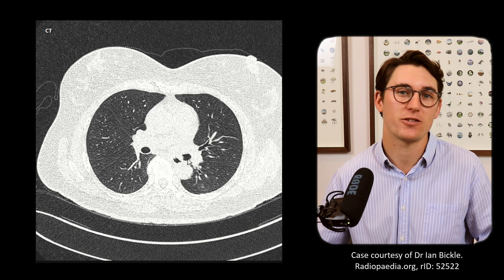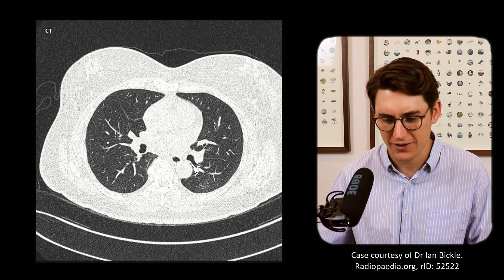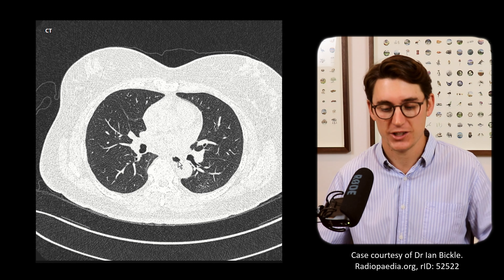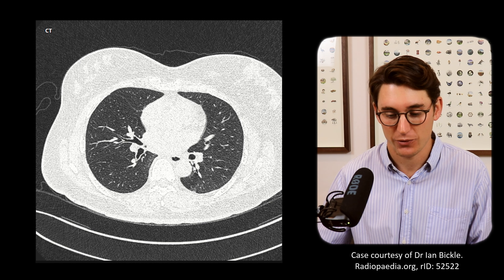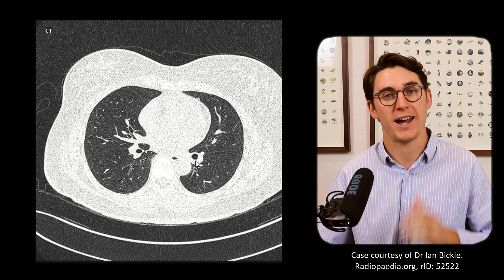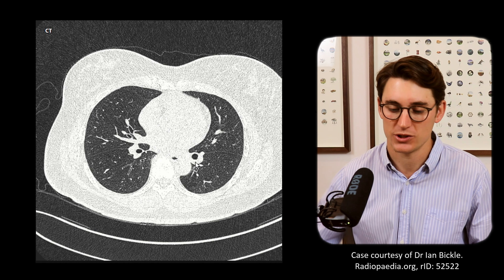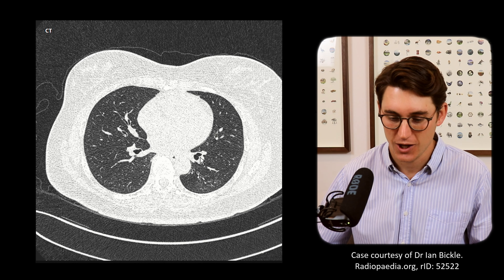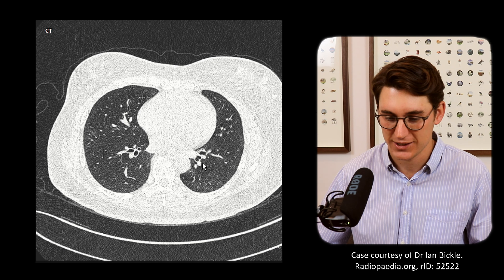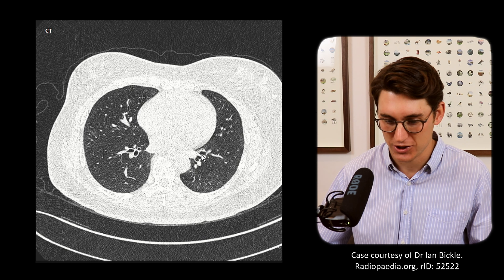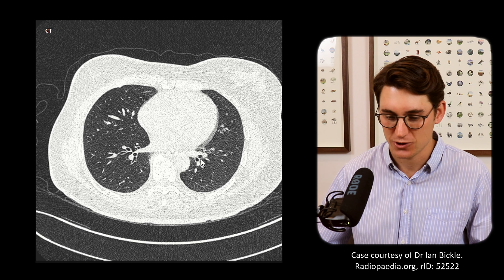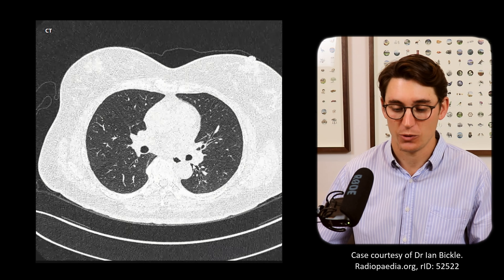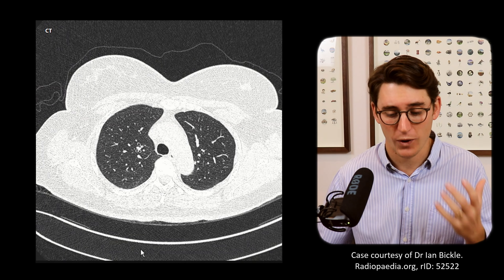Following the left lower lobe bronchus, again posteriorly and quite early on we have the superior segment on the left, just as on the right. Continuing further down we see the anteromedial branch before it bifurcates into medial and anterior, then the lateral branch, and finally the posterior branch. We can follow each of those all the way out to the lung peripheries.